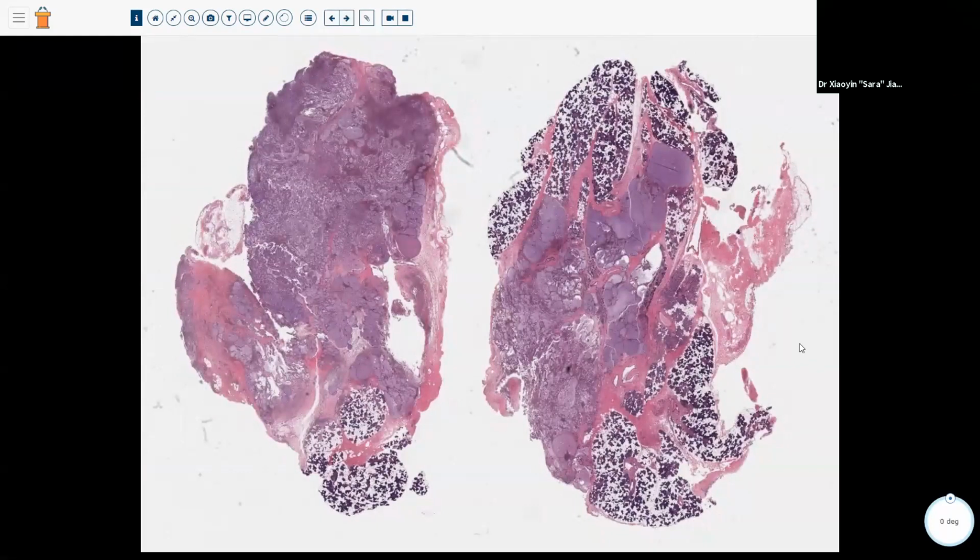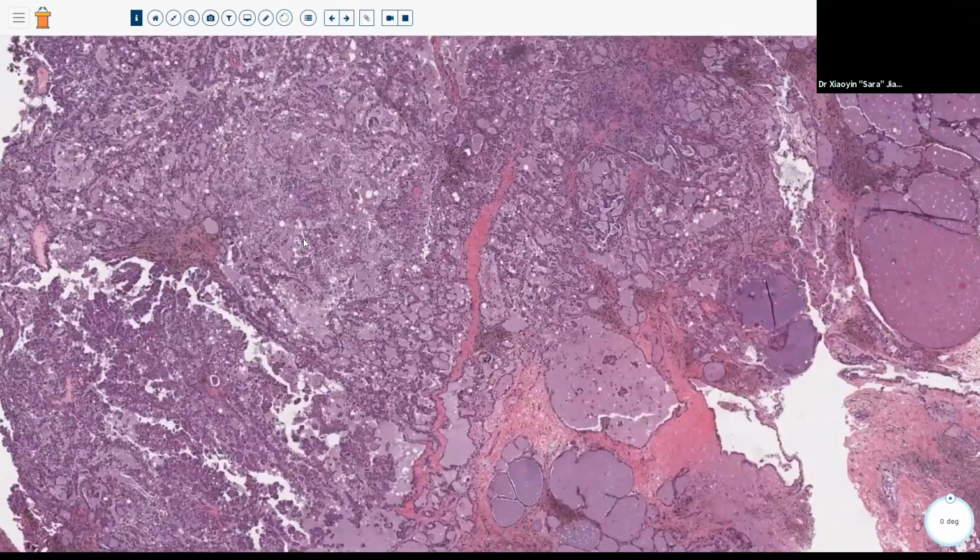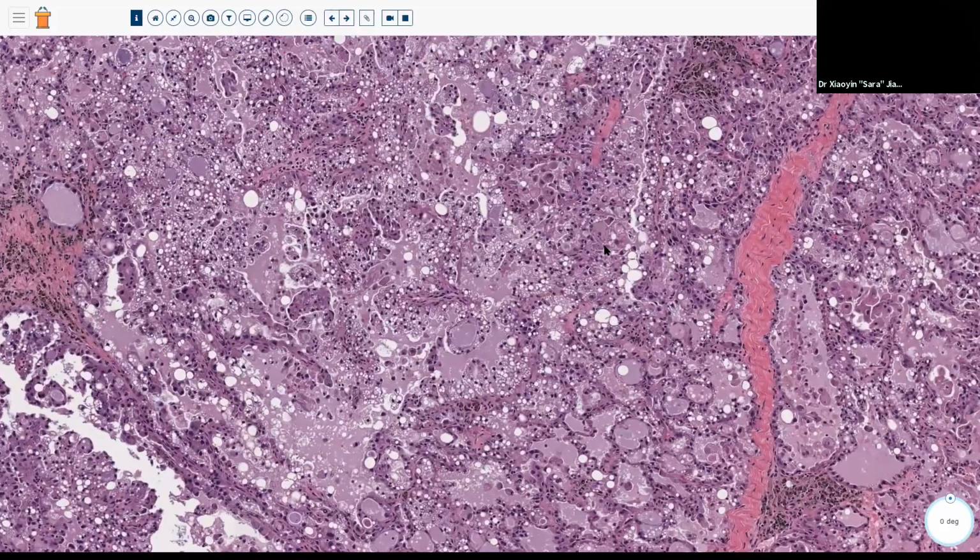All right, so moving on to our next case, mammary analog secretory carcinoma. Actually, sorry, I just gave away the diagnosis, but it's up there so you guys can see it already. Again, let's look at the infiltration or borders of this tumor. So again, kind of a lobular tumor, not the most well circumscribed tumor. And as we go on higher power, let's see what cell types this is made up of.